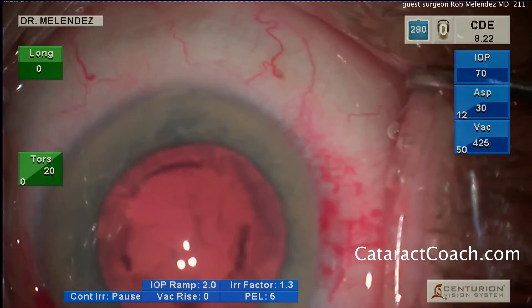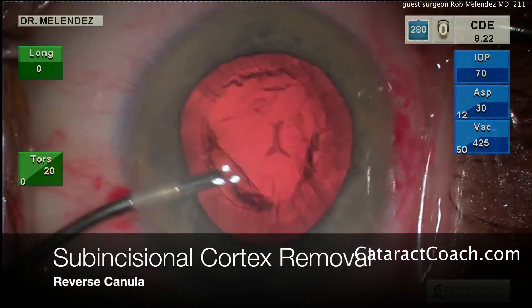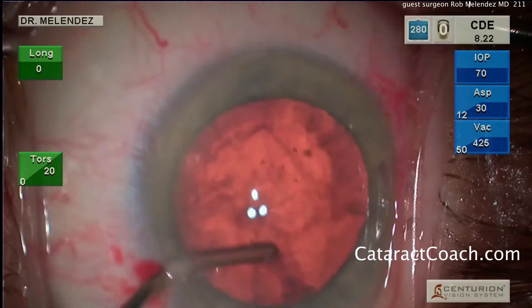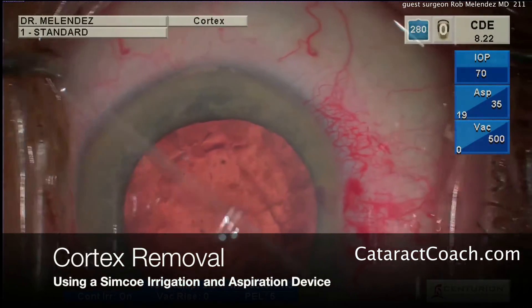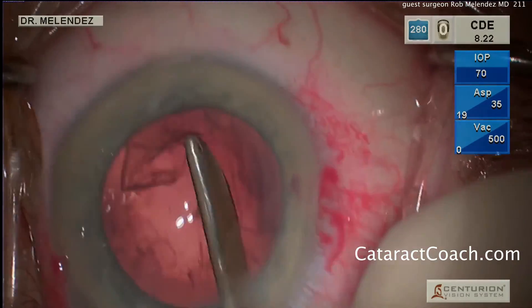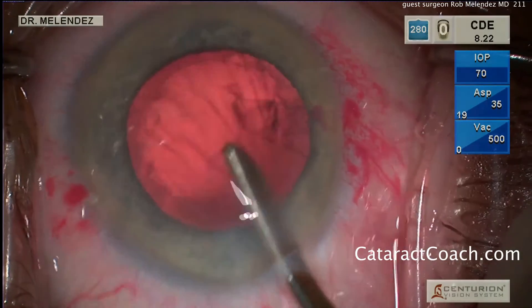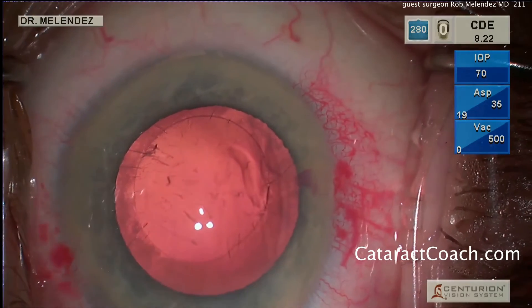Now here's something a little different. That was a beautiful removal of the lens nucleus. Dr. Melendez is going to remove the subincisional cortex first using just an aspirator device — no infusion going into the eye, just a little aspiration. He's careful to aspirate only a little bit at a time and back-flush if needed. Now the Simcoe device is being used to remove the cortex — this is a manual device for simultaneous manual irrigation and aspiration. The Simcoe used to be far more popular, and you can see from this video it's still very effective in Dr. Melendez's hands. There's the last bit of cortex being removed, and that looks great.